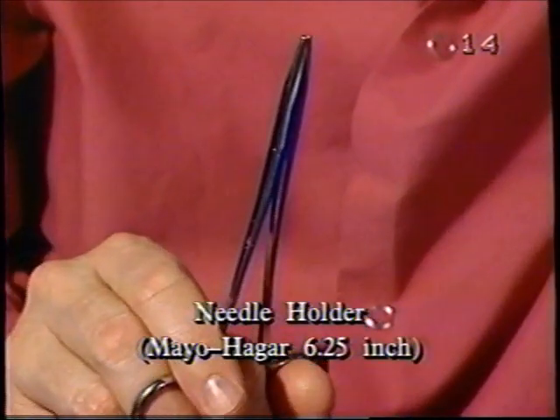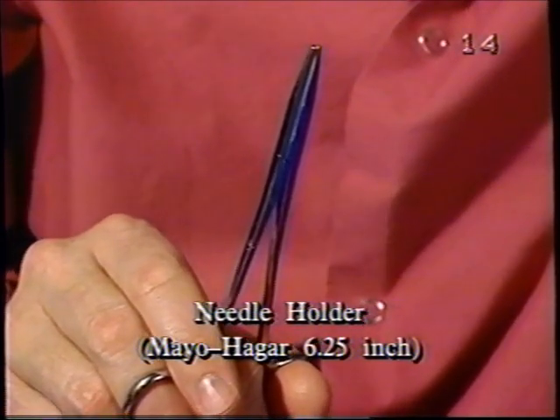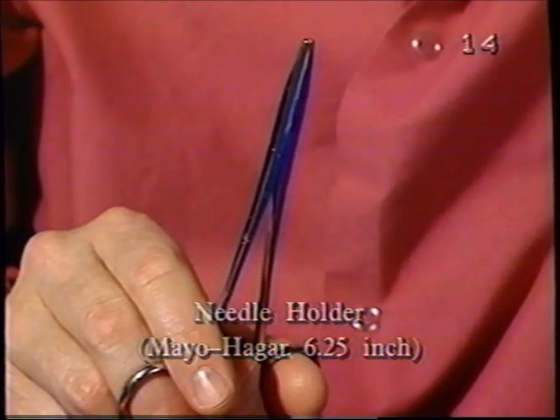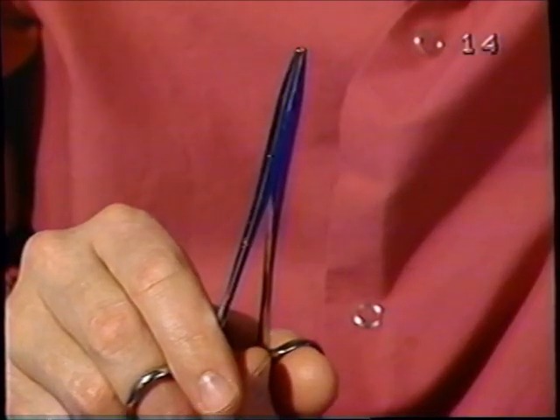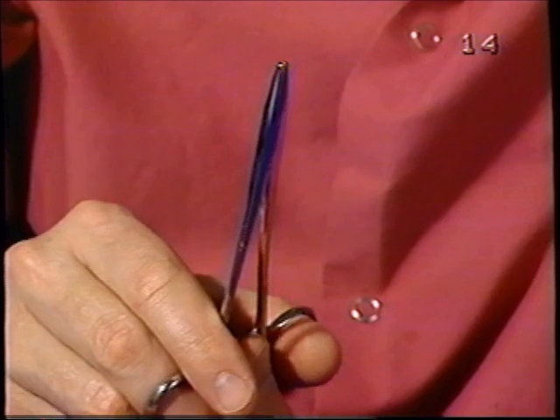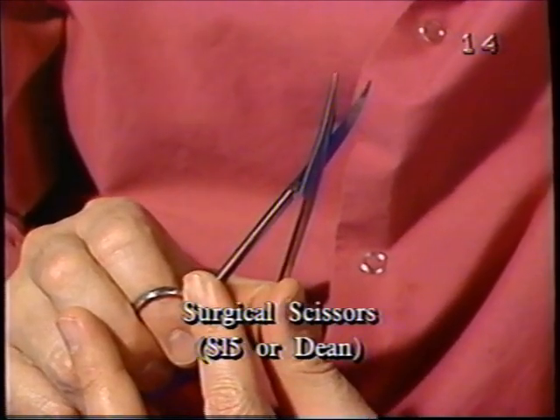This is the Mayo-Hegar 6 1/4 inch needle holder. It's good for the anterior of the mouth, and it's also good for the third molar area. It's big enough to hold the needle securely, and it gives me good visibility around it. This one is my surgical scissor.